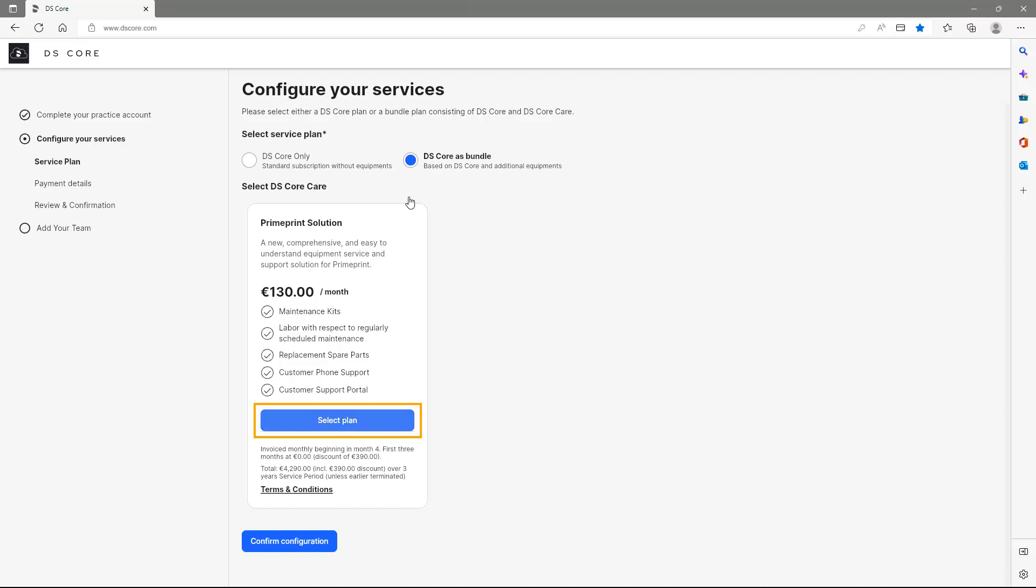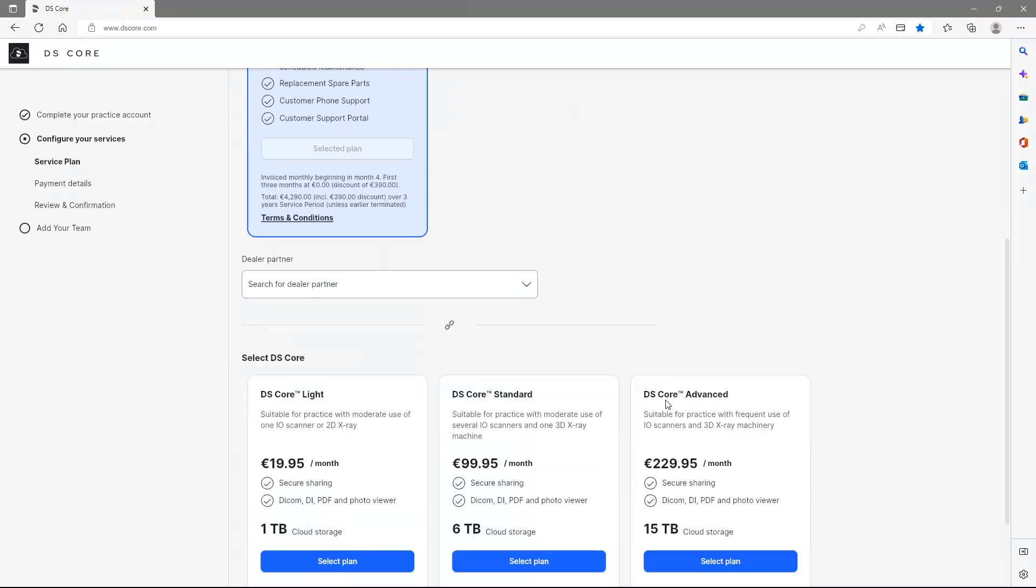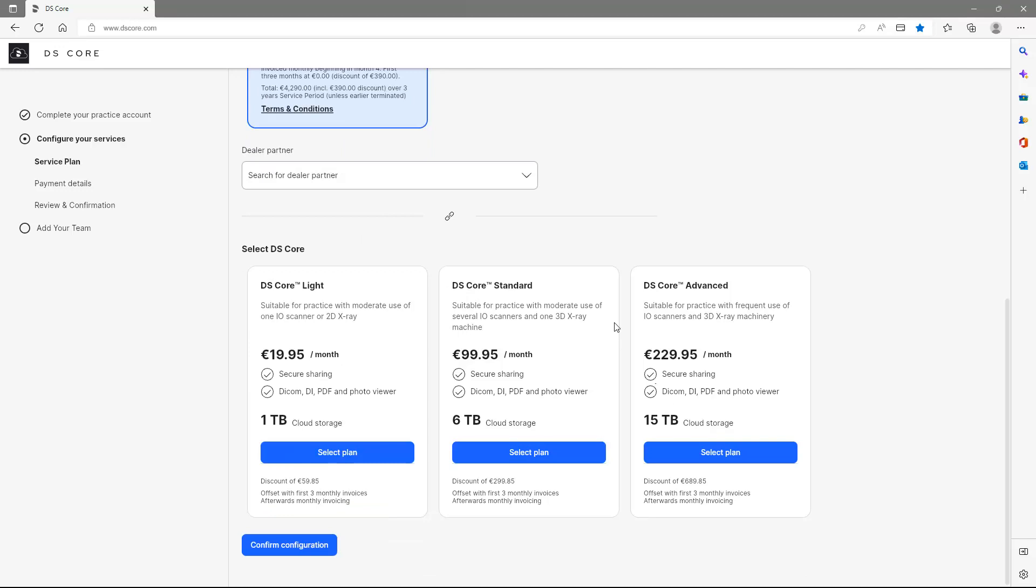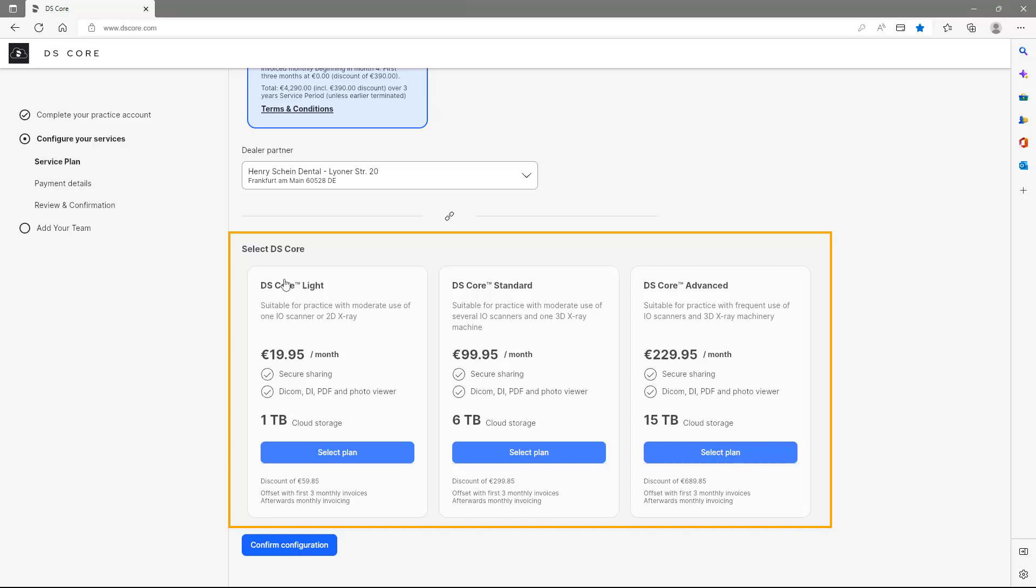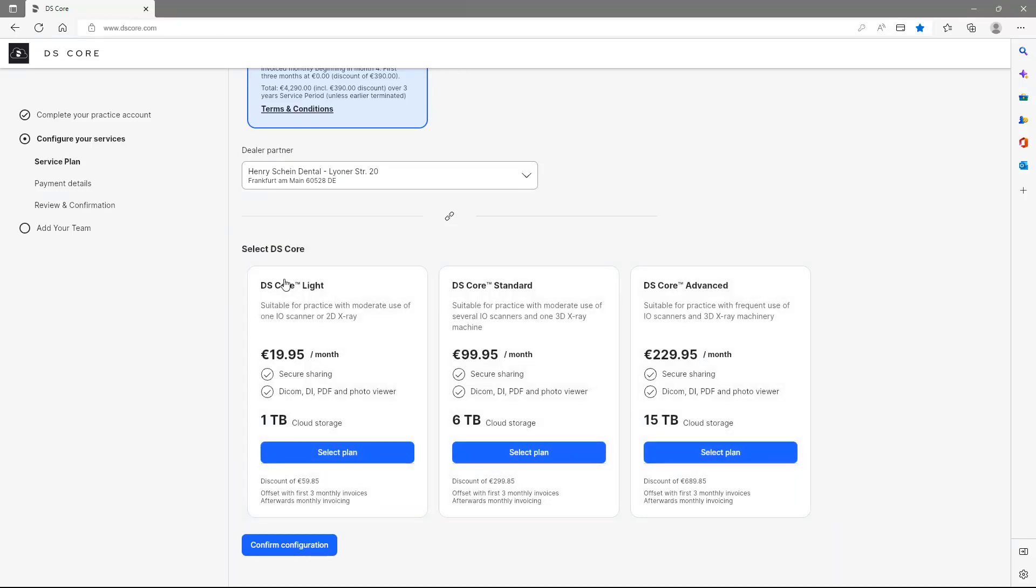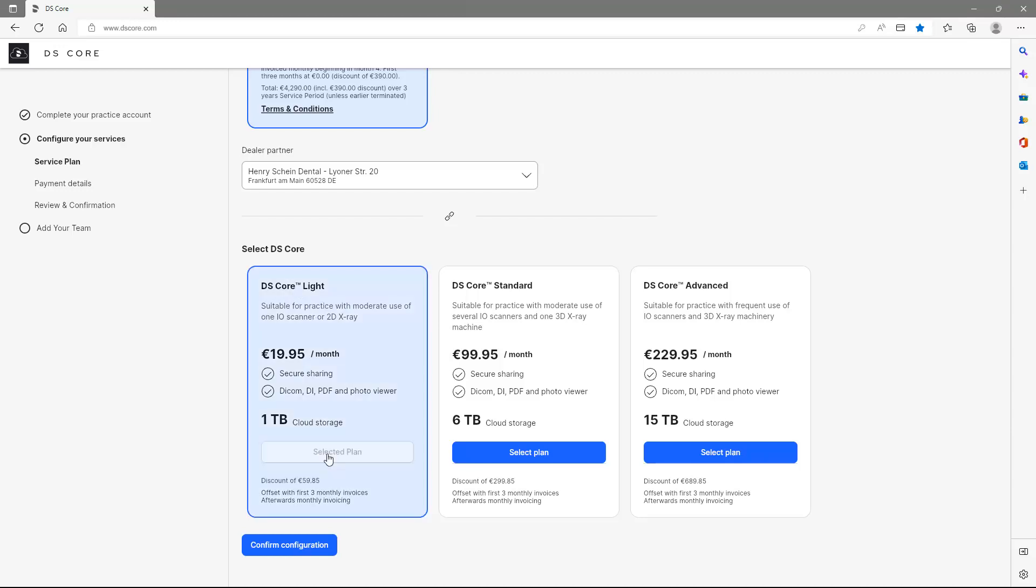We confirm our choice and use the drop-down menu to search the dealer partner from whom we ordered the solution. Afterwards, you can choose between three subscription models. As an example, we select the first subscription, DSCore Lite, and then tap on Confirm Configuration.